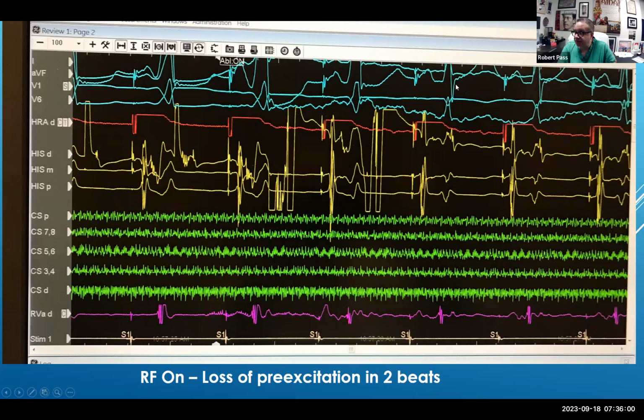Now, the reason that there's no signal on the coronary sinus catheter is because I probably took out the CS and am ablating this patient from the right IJ. And that's just a technique that I prefer to use for this. We've published this and it's been around for a long time.